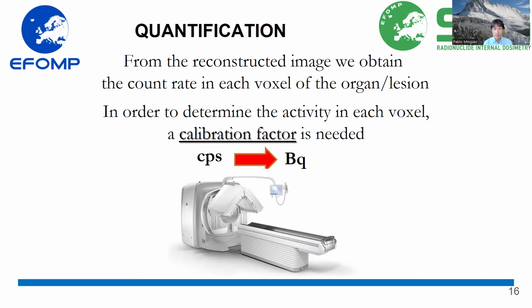It's good to remember that our image will not be perfectly reconstructed because there will be statistical noise, and the spatial resolution is not going to be that good.